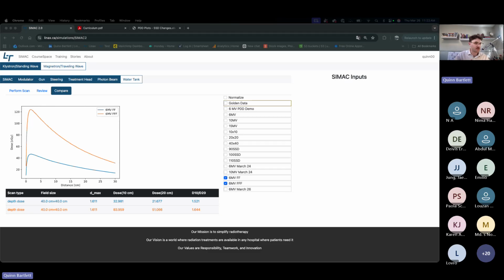allowing more photons to reach the patient directly along that central axis. I think we understand that our flattening filter is going to flatten our beam and take away a lot of the photon energy. It's going to harden that beam a lot. And if we don't have that flattening filter, we're going to get much higher dose. And that's what we see for things like electron treatments.